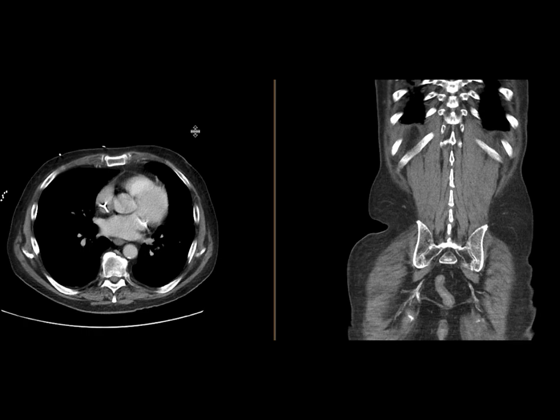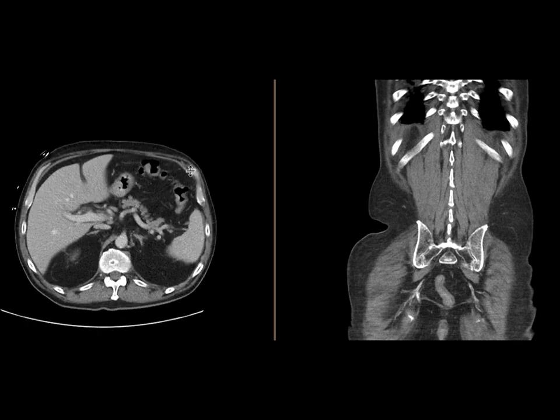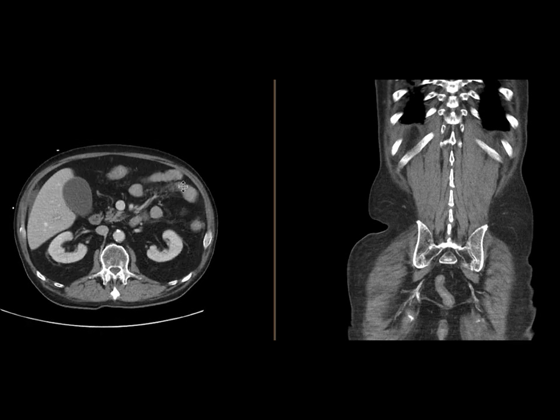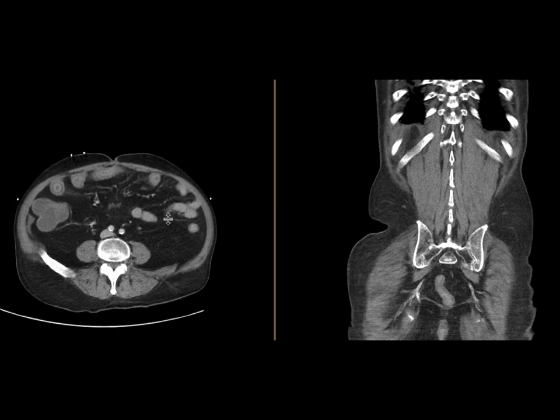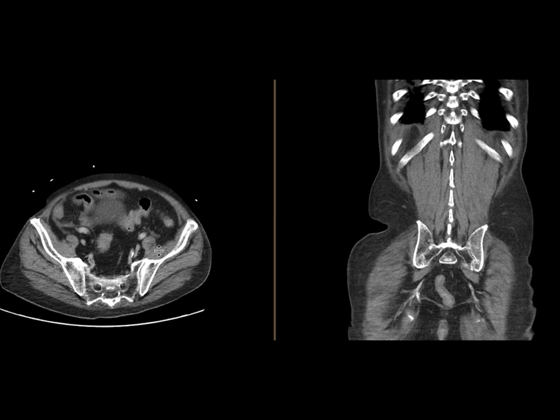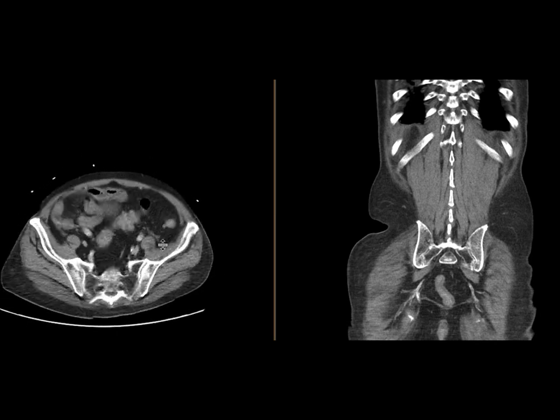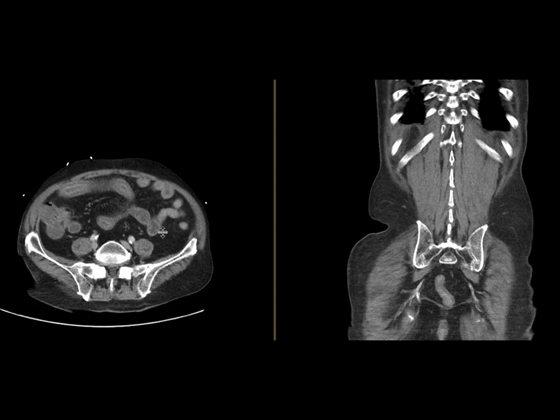This is a patient who came with abdominal pain and got a CT scan of the abdomen and pelvis with intravenous contrast. We can see that there is abnormality involved in the small bowel — it's quite diffuse in that multiple loops of small bowel are quite thickened.